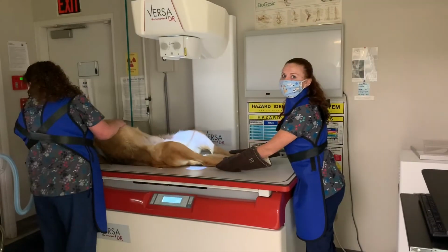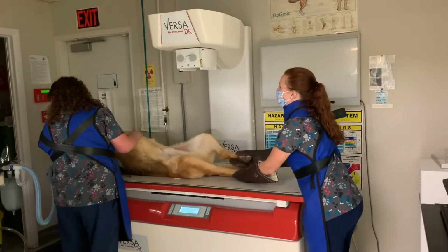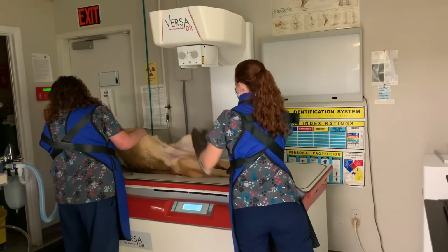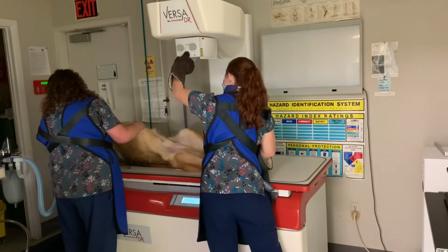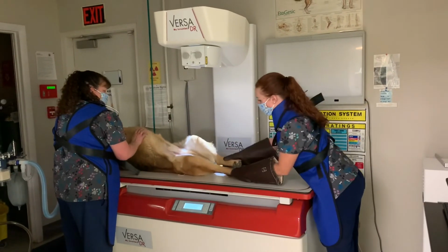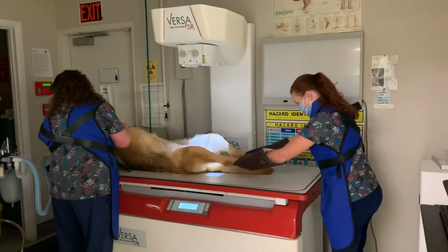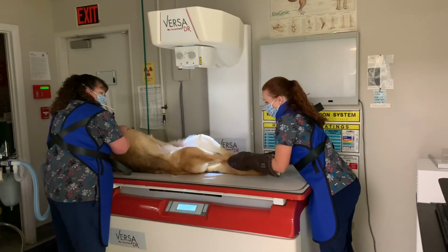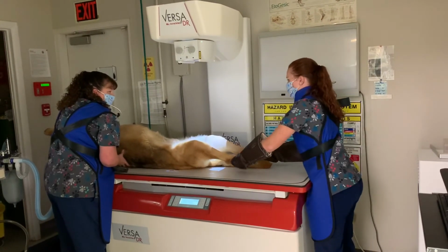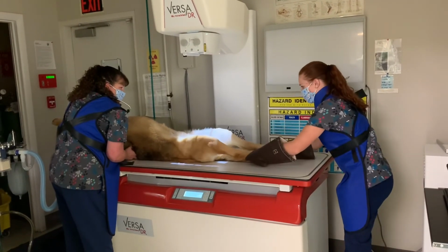So to take the VD pelvis, you will want them in dorsal recumbency. Your crosshairs will be just distal to the patellas and cranial to the crest of the ilium. And then to be able to get this view, you will want to pull the legs out and rotate them inwards, keeping the pelvis straight. You want the tail aligned with the spine.